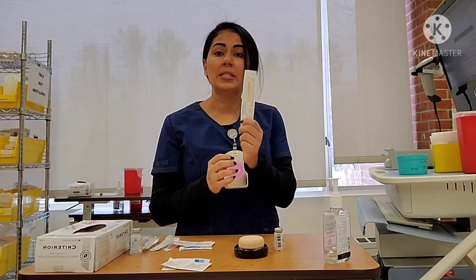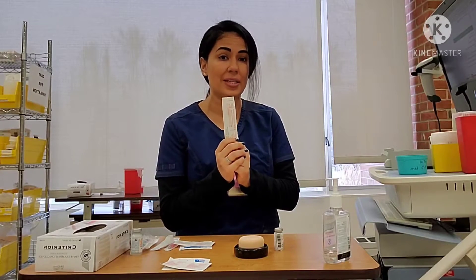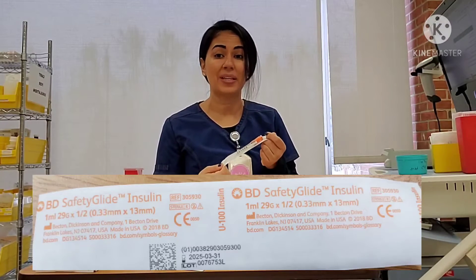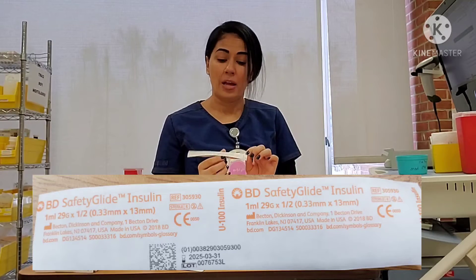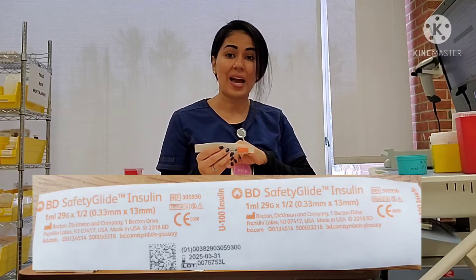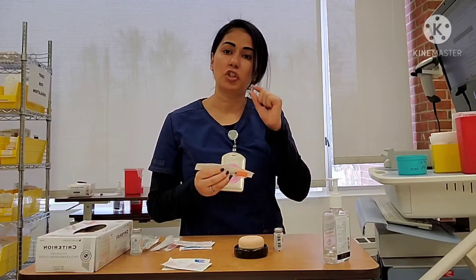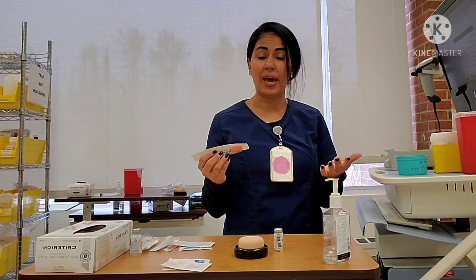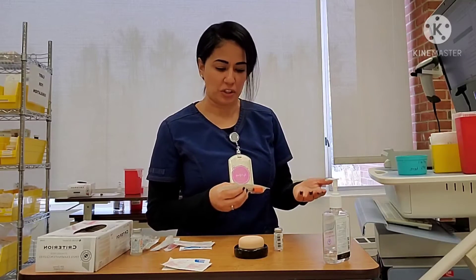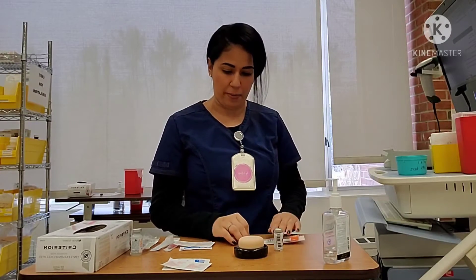I'm going to grab an insulin syringe. I always use an insulin syringe when administering insulin because it comes in units rather than milliliters. This syringe is a one milliliter syringe, but it comes in units. It's a 29 gauge needle — that's the diameter — and it's half an inch long, which is an appropriate needle length for a subcutaneous injection. Everything is all together; I don't have to choose any needles. I'll also need two alcohol swabs, one for the patient and one for the vial, and a gauze.